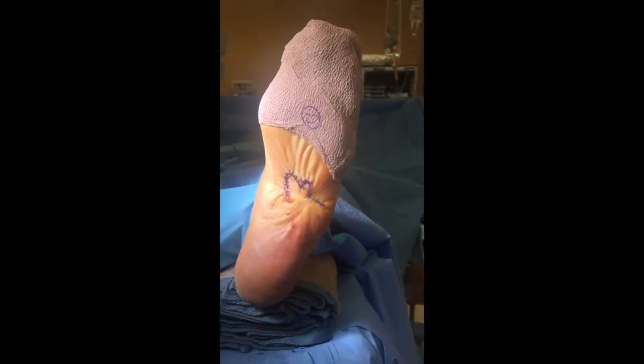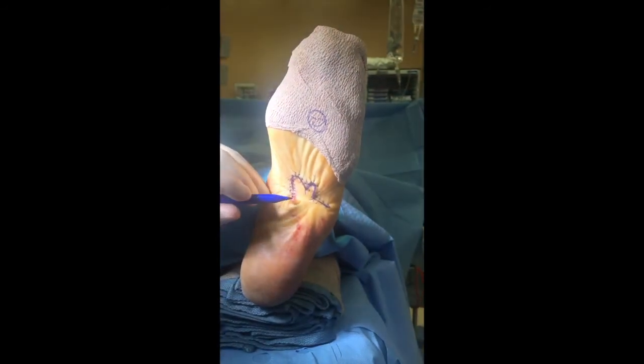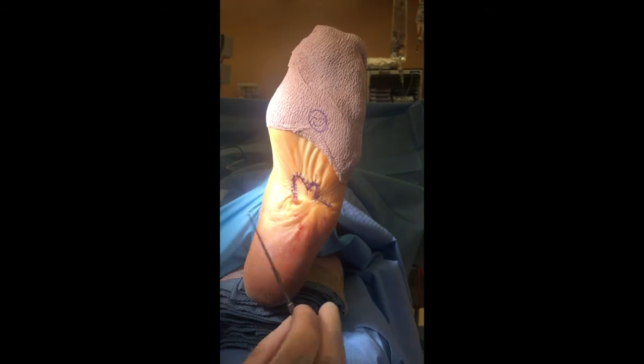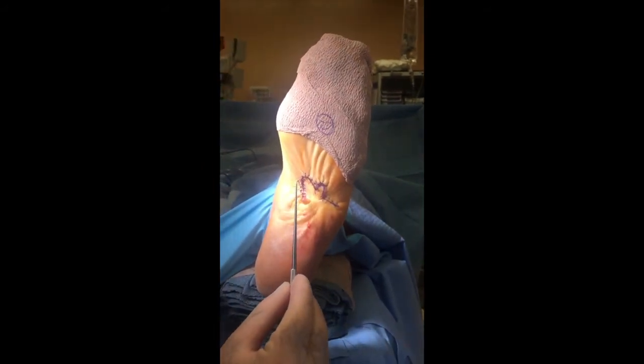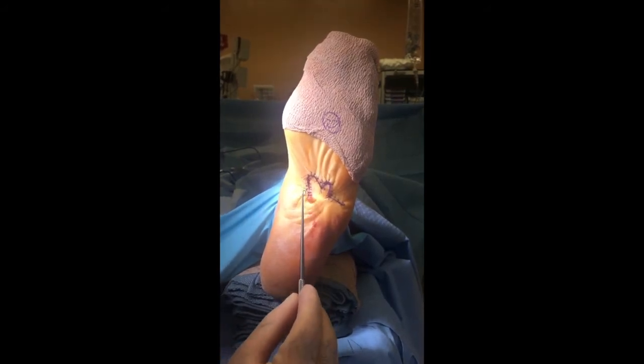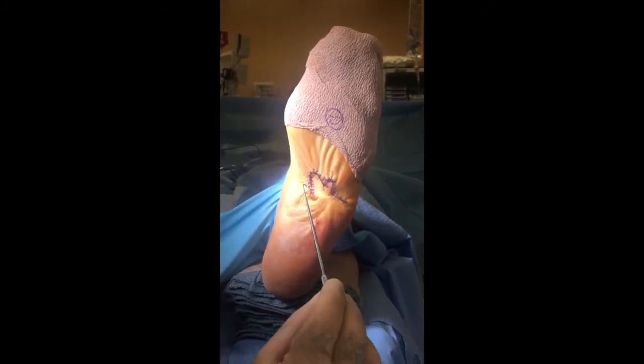We've closed our defect with the flap and you can see we're left with a little bit of a dog ear right here. The way to handle this is with a Burrow's triangle. This is the line of incision right here, as the single prong skin hook is showing you.